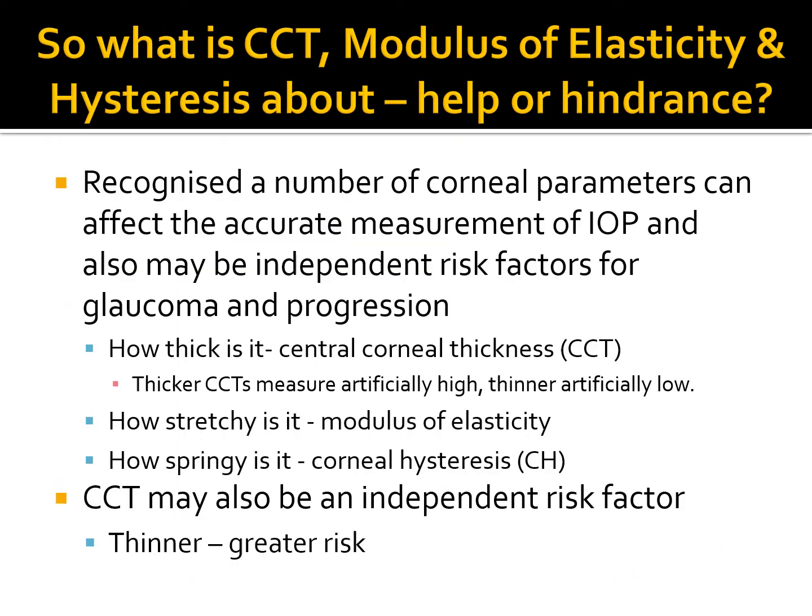Let's have a look at it. So this is the question I'm putting: what the hell is CCT, modulus of elasticity, and hysteresis all about? Is it a help or is it a hindrance? I don't know if you know these things, but the term hysteresis has come into our vocabulary since the ORA was developed, and it's bandied around. This particular author says it's recognized a number of corneal parameters can affect the accurate measurement of IOP and also may be independent risk factors for glaucoma progression.